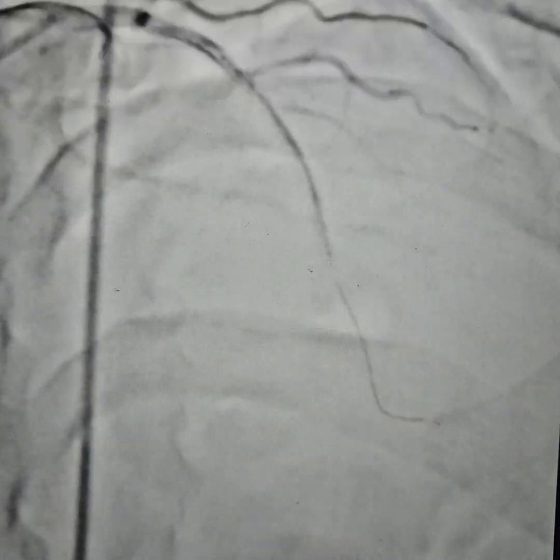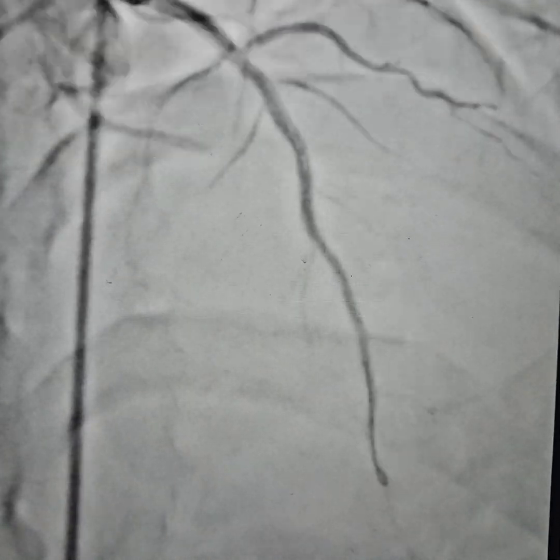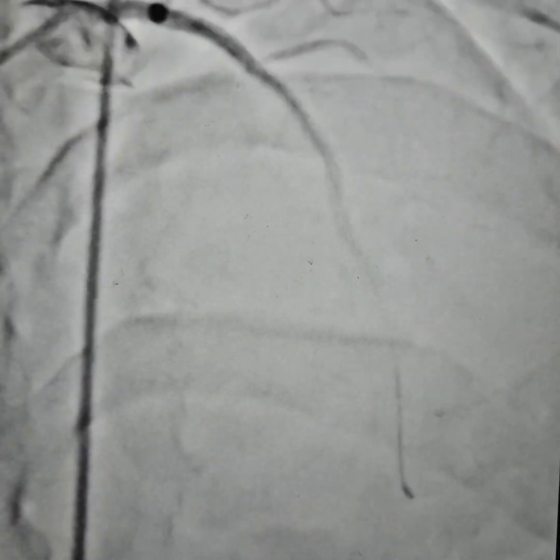We are now deploying the stent. The stent has been deployed, and after deployment we can see that the artery has opened up quite nicely. This was a 3 mm stent. We are then doing some post-dilatation with a 3.5 mm NC balloon.